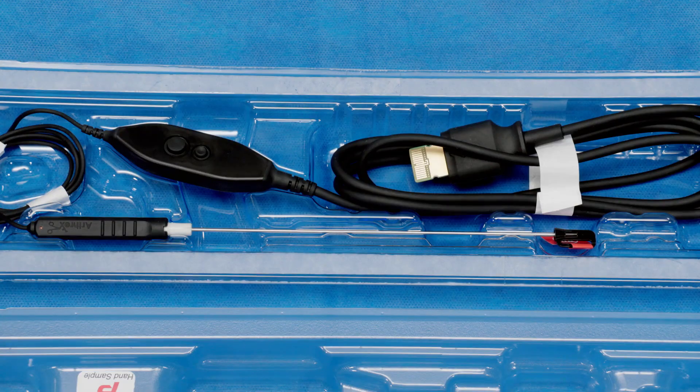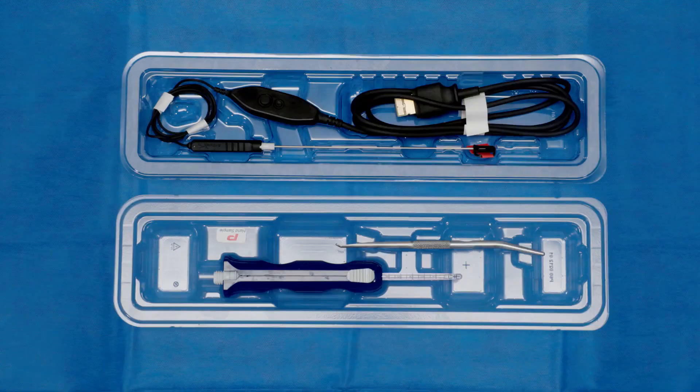This plugs into the nanoscope console, and this whole system produces no heat, which means no fogging. Without having a tower, it decreases your footprint, which means you can be in a much smaller room and even a procedure room. This also decreases the setup time since there's not multiple trays to open, so this will not be the rate-limiting factor in how many surgeries you can do in a day.